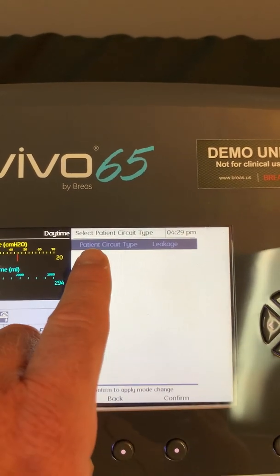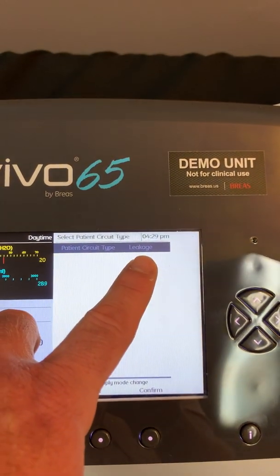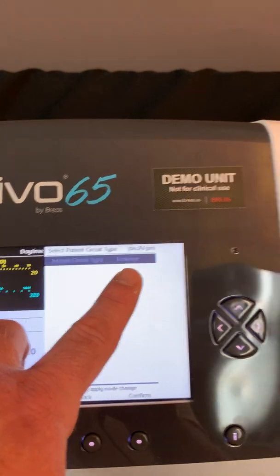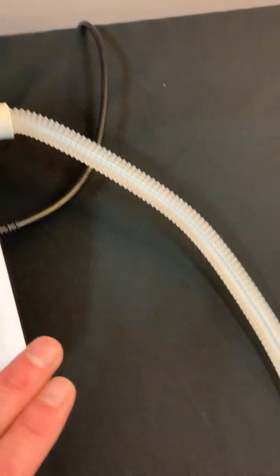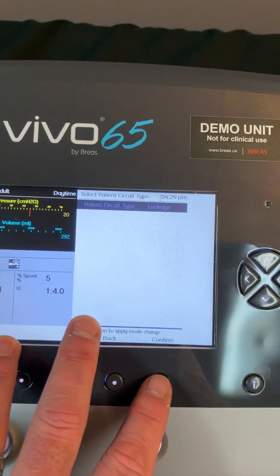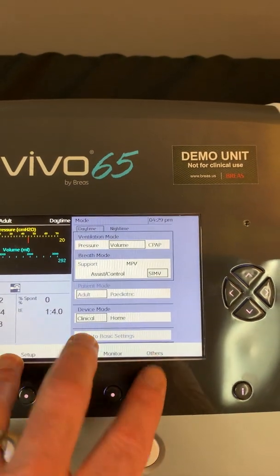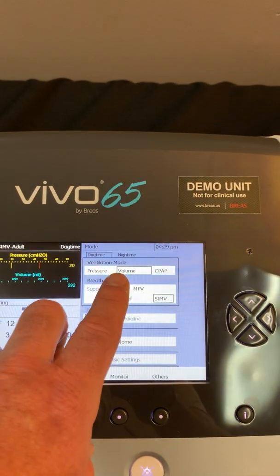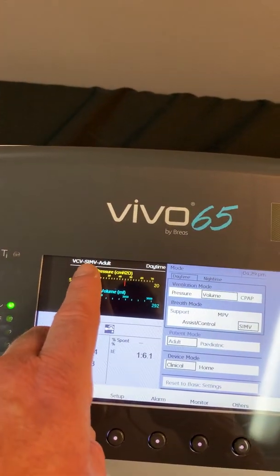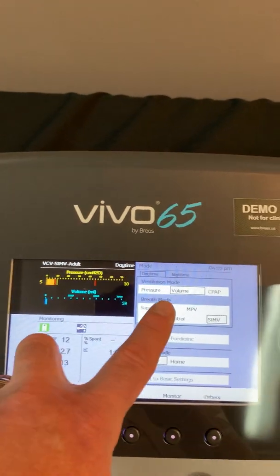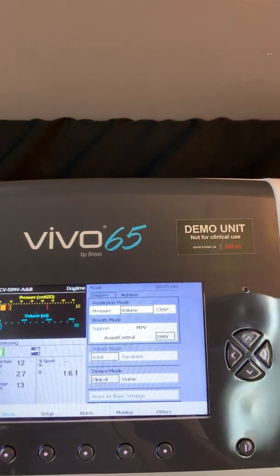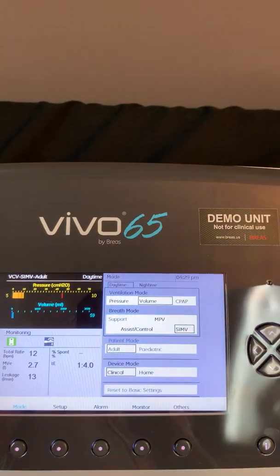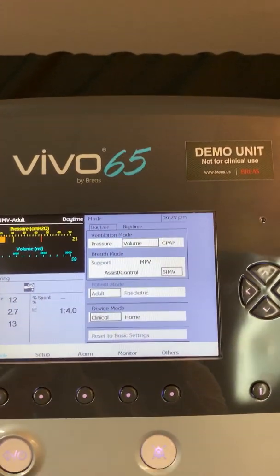It's now asking me to confirm that I do have a leakage circuit attached to the device. I do have a passive circuit attached to the machine, so I'm going to click confirm. Now I am in a volume SIMV setting, and I have changed the mode of ventilation. That's how you can change the ventilation mode.